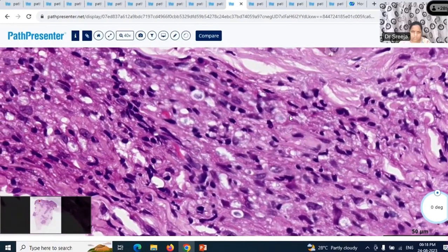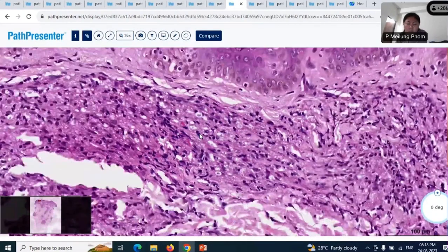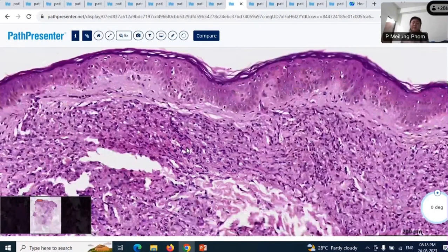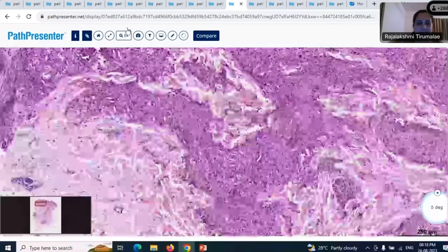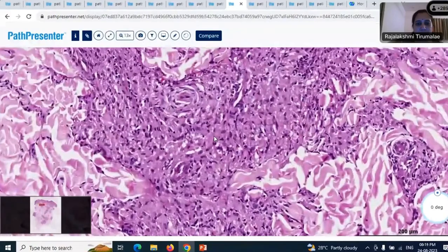So this is described as the blue-gray cytoplasm. Okay. Yes, ma'am. So you have foamy histiocytes with blue-gray cytoplasm, right? So what is the blue-gray? We'll come to it later. And I'd like to point out one more feature.